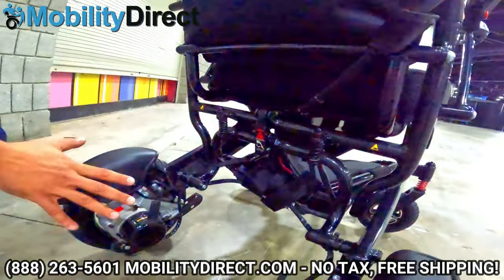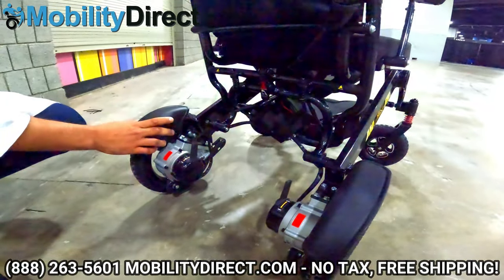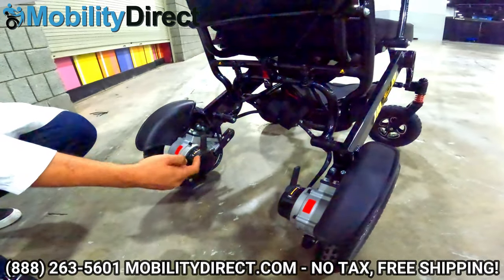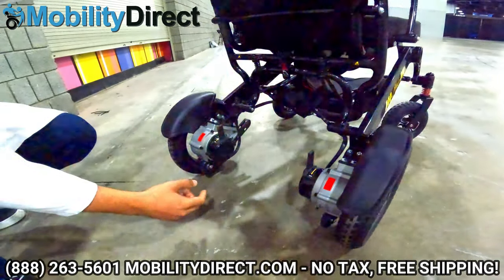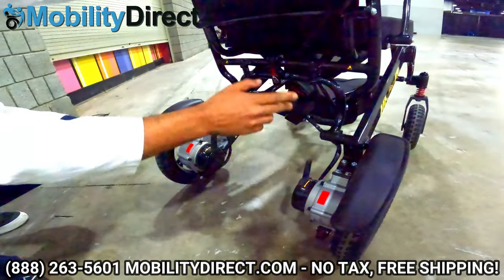This chair has two motors in the rear, and the automatic braking system prevents you from rolling down a hill uncontrollably if you run out of batteries. However, if you want to push the user manually, you just turn off the braking system and the brakes are disengaged so you can push it like a manual wheelchair.